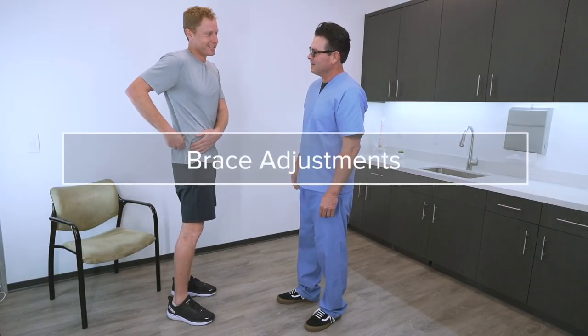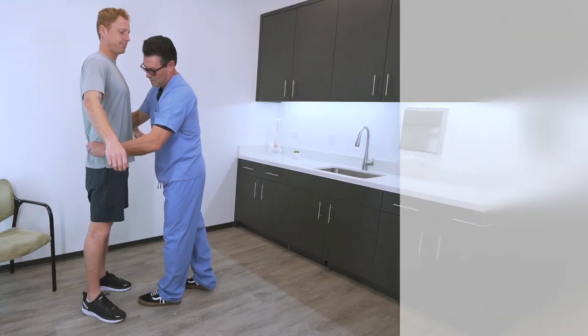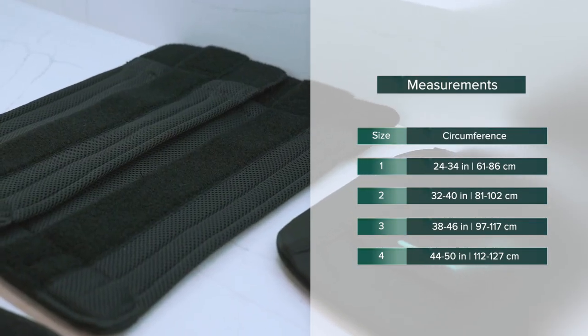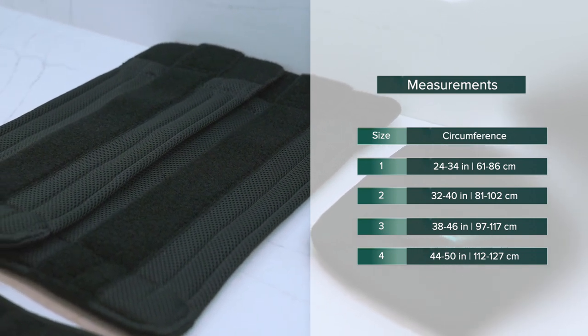Clinicians can find the correct size of the Horizon Pro by measuring the patient around the waist and using the sizing guide included in the instructions for use. Lateral extension panels are available that allow the Horizon Pro to fit waists up to 70 inches.